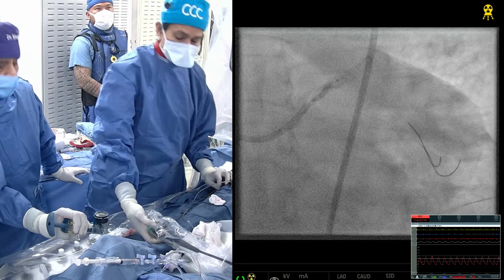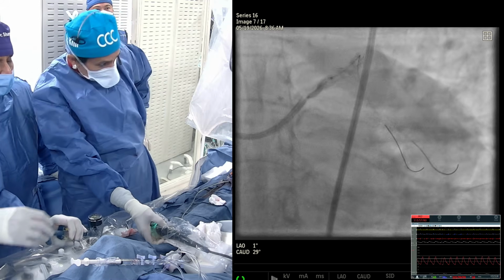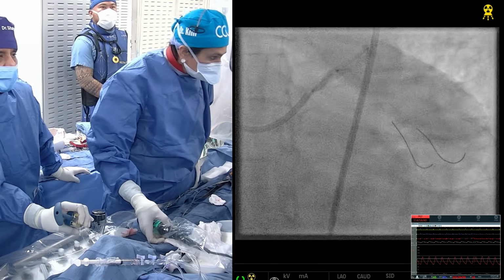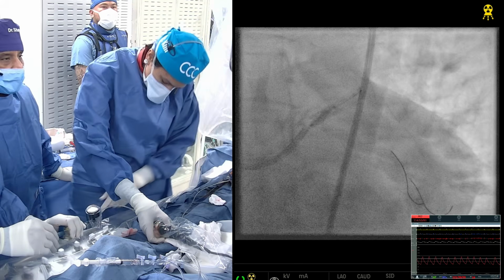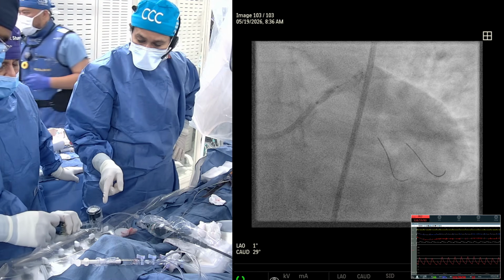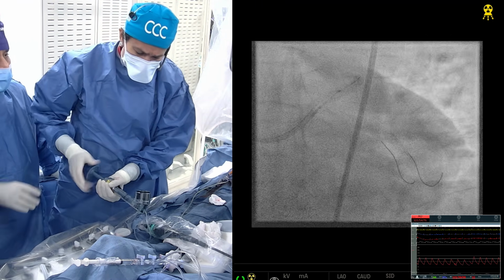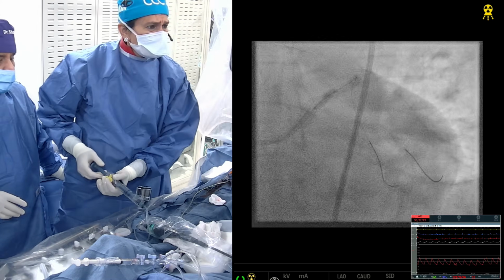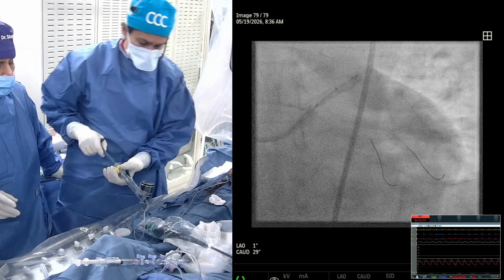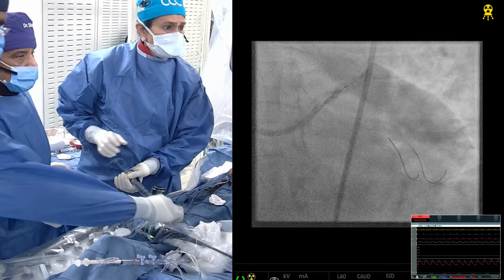Look at that. You can do an even bigger one. Remember I said 4.0? Now this is the Aero, the more flexible IVL catheter, which is very good, but we found a little more rupture of this because the balloon material became thinner, and that is what we saw. You have to leave it for a few seconds. Good. So let's go back again. 2 atmospheres and then you go up.